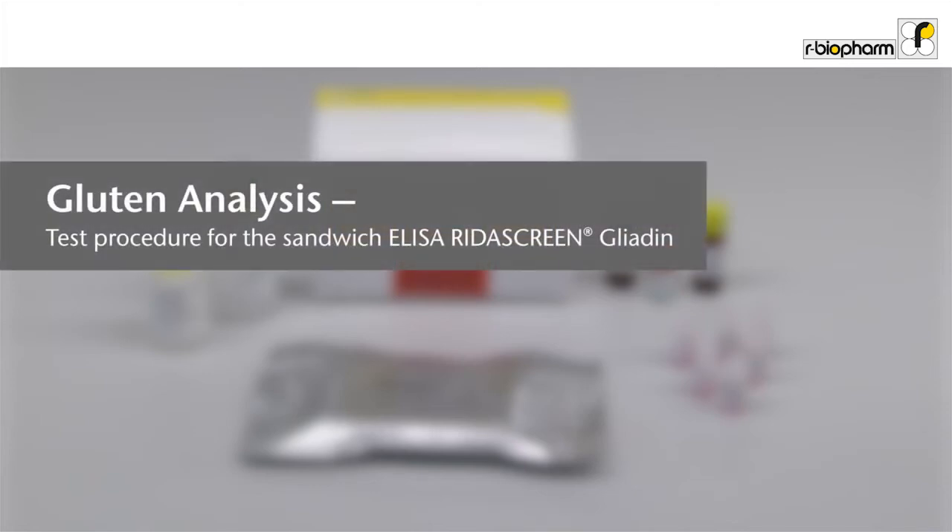Gluten Analysis Test procedure for the sandwich ELISA RIDASCREEN Gliadin. RIDASCREEN Gliadin in combination with the cocktail patented is the most used method for gluten analysis worldwide. It has been validated in two international collaborative studies and is now an official AOAC-OMA and AACCI method.